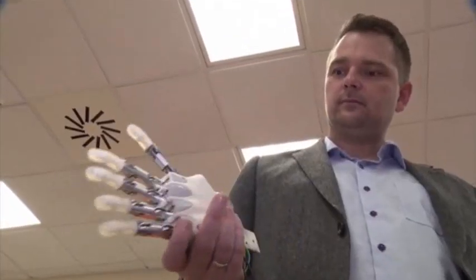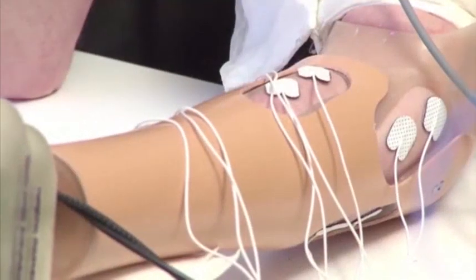Suddenly my hand is talking to the brain again, if you wish, and that was incredible. A sensation that would have been unimaginable decades ago is now possible thanks to this robotic hand.